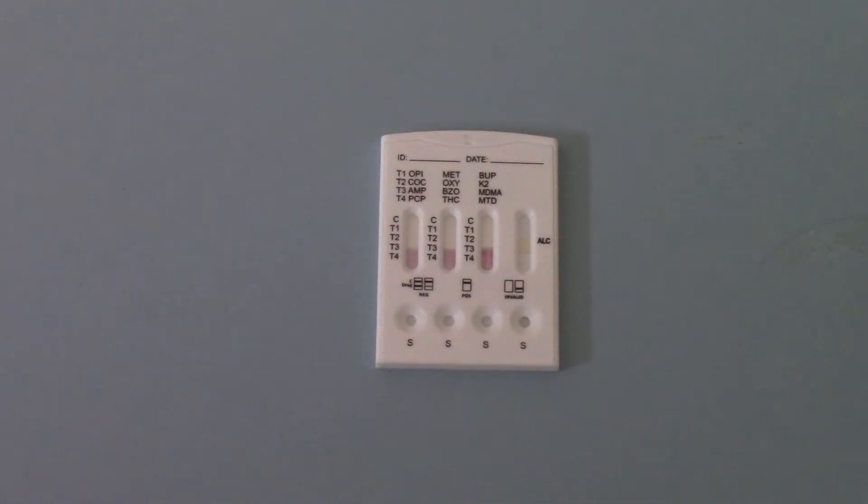Leaving a white background, and you will have, if they are negative results, test lines forming against all those T1, T2, T3 and T4 lines and a nice clear control line at the top.